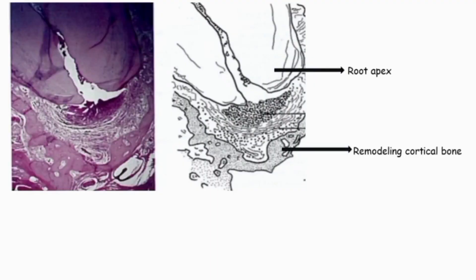Histopathology of periapical granuloma. This arrow shows the root apex where the periapical granuloma will be forming, and this arrow shows the remodeling cortical bone, and this arrow is representing the outer fibrous tissue.